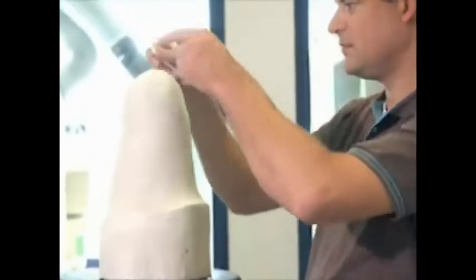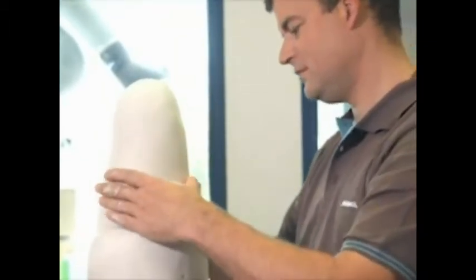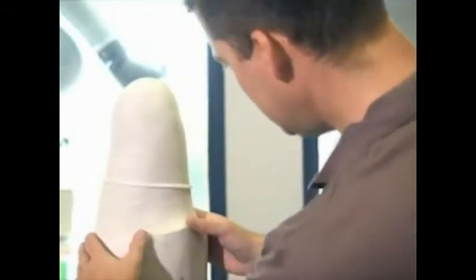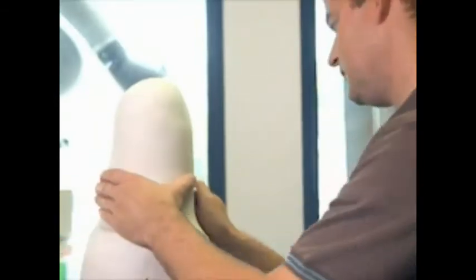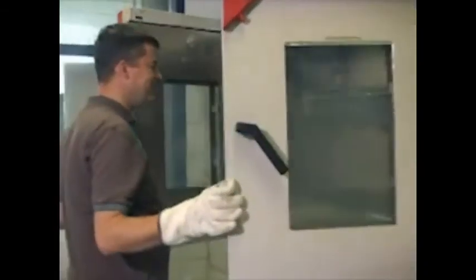Then position the dummy to the ProSeal ring on the plaster model without applying too much pressure. Conventional method for vacuum forming the socket.